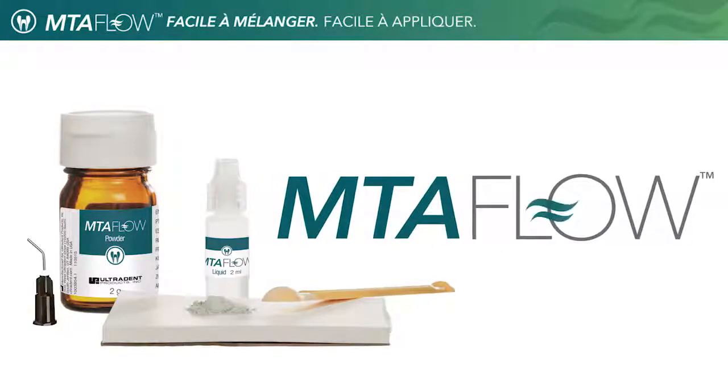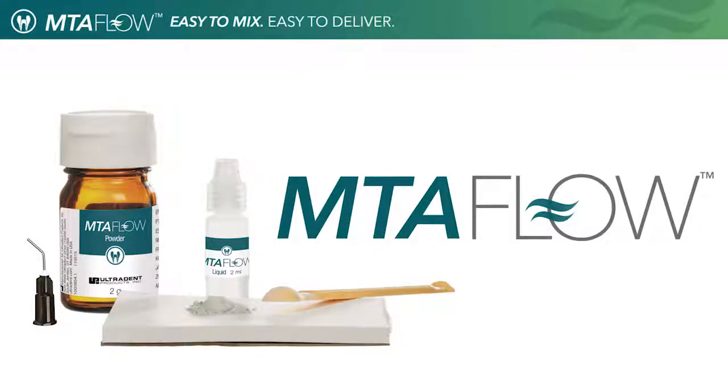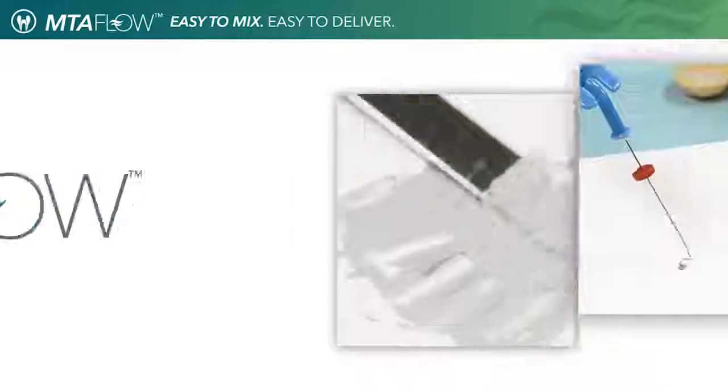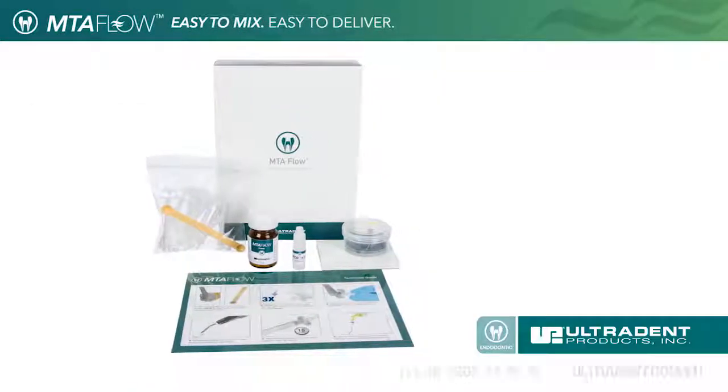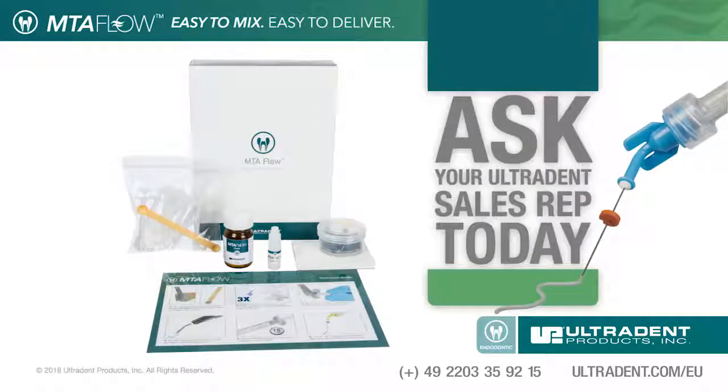Ultradent's MTA Flow — easy to mix, easy to deliver, and the right consistency for the right procedure. For more information or for a product demonstration, contact your local representative.